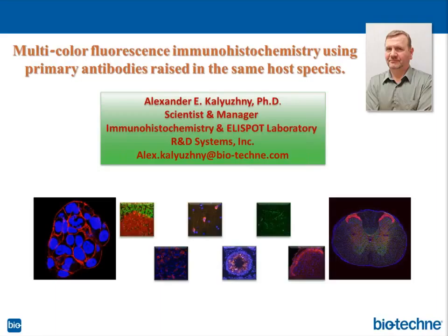So yes, when we talk about frozen sections and retrieval, we know that antigen retrieval on frozen sections versus paraffin-embedded tissue sections is not working, because frozen sections are very sensitive to retrieval. They may get damaged by retrieval treatment. Speaking of staining, there's no difference in staining frozen tissue sections versus paraffin-embedded tissue sections.